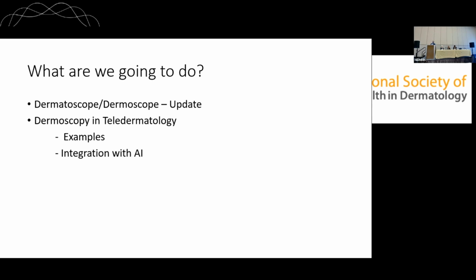So, show of hands, how many of you remember how we used to start with the dermatoscope? These were small keyhole devices, and we were going so close to the patient, especially on the face, that they would be like, what are you doing? But that's how small and tiny it was, almost like a keyhole.